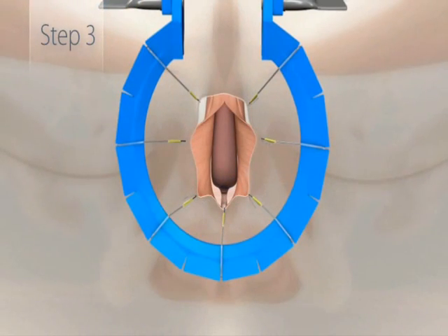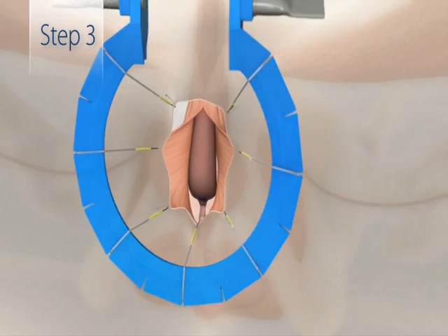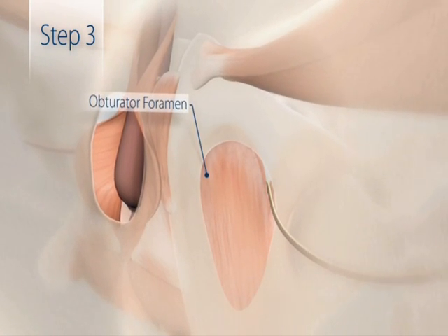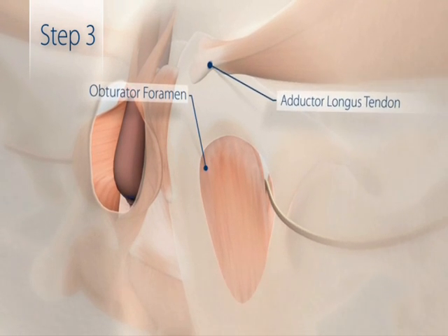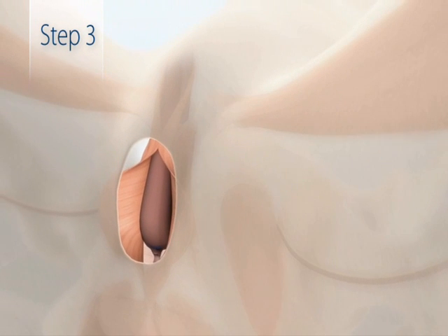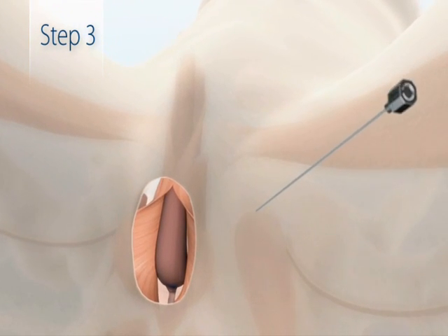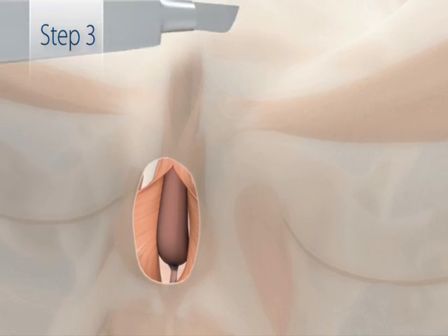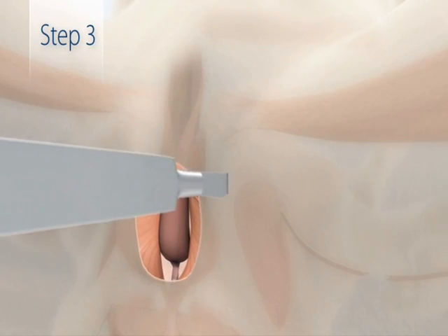The Advance XP helical needle passer will be inserted into the obturator foramen about 1 finger breadth below the adductor longus tendon, just lateral to the ischial-pubic ramus. To identify the proper insertion site, palpate the inferior pubic ramus and feel for the bony landmarks. Make a small stab incision at each needle entry point.